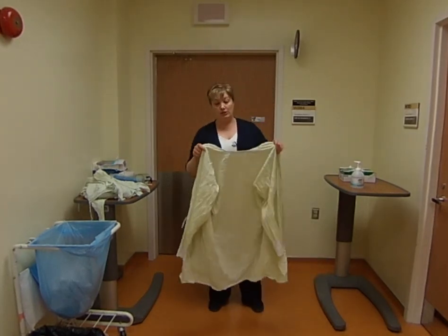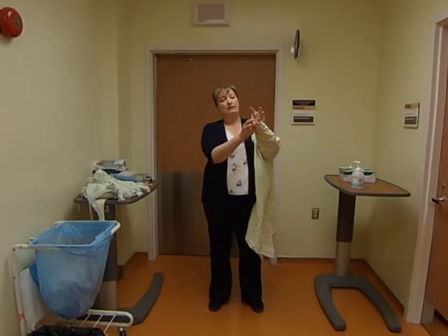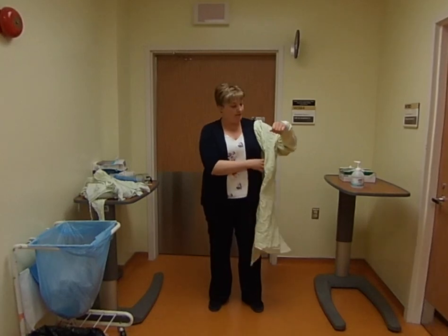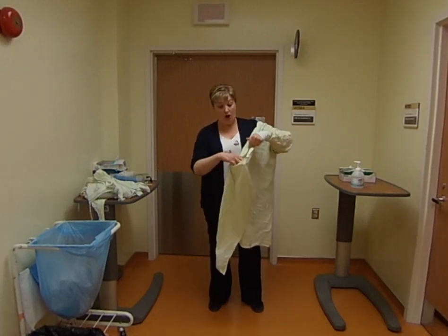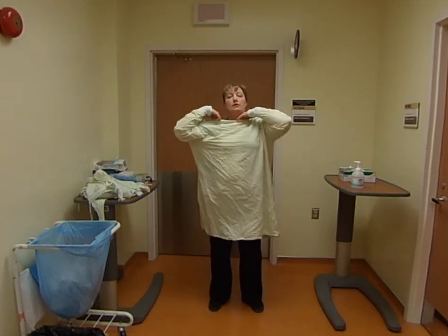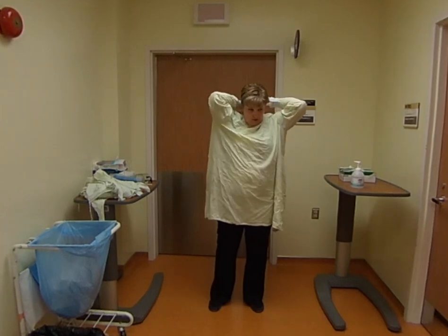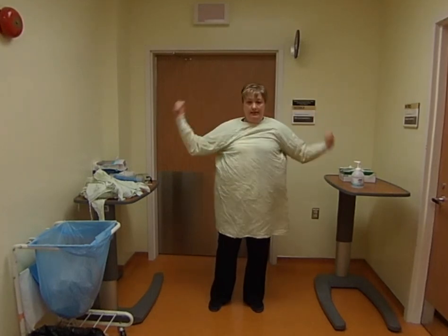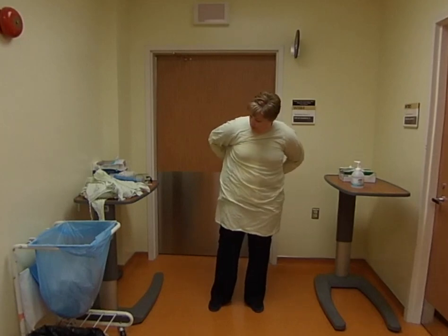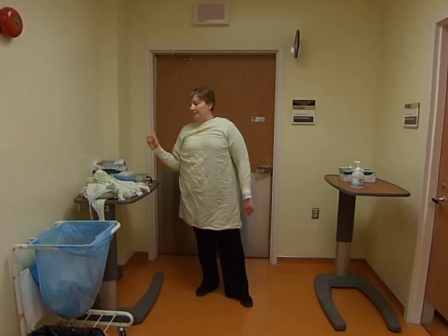It's important to make sure the ties go to the back, not the front. Put your arms in and leave the cuff over your wrist, because you want to cover your watch — in fact it would be better if you took your watch off before doing this. Tie it up at the back, then also tie it at the waist to provide that extra protection.